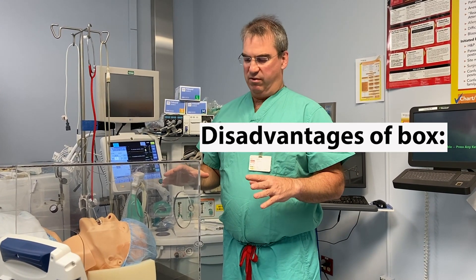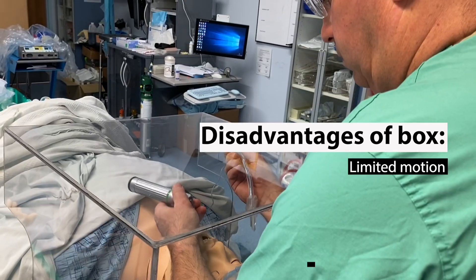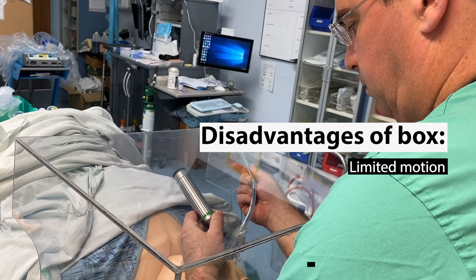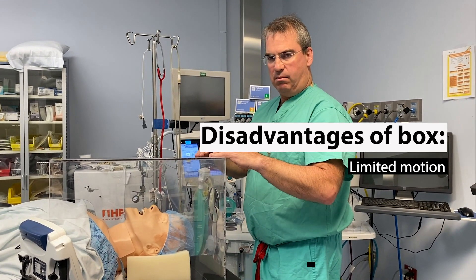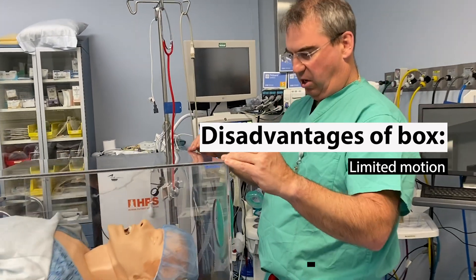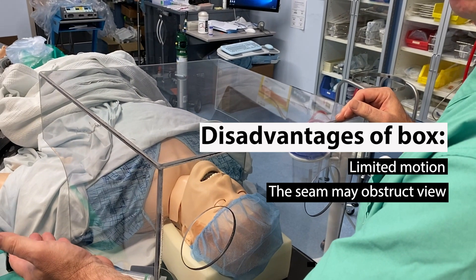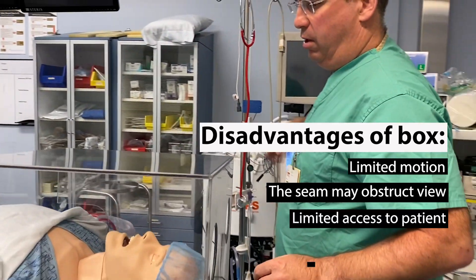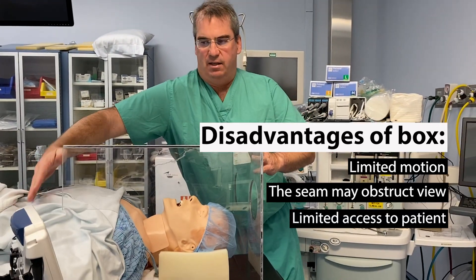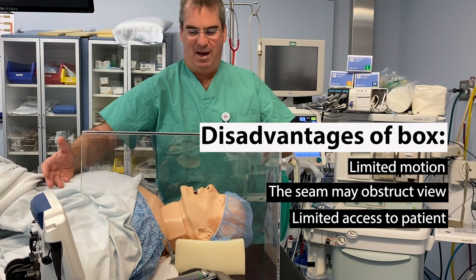This is just to demonstrate some of the problems we've encountered with using the box. One is that once you put your hands in, you're limited in motion to where your hands are — that doesn't happen when you're under the plastic. It also has the seam, which has potential to impair your view of the airway if you're doing direct laryngoscopy. If you're doing video laryngoscopy, it doesn't come into play. And as I alluded to before, you still need to put plastic on to keep everything from creating droplets coming out the bottom of the box.